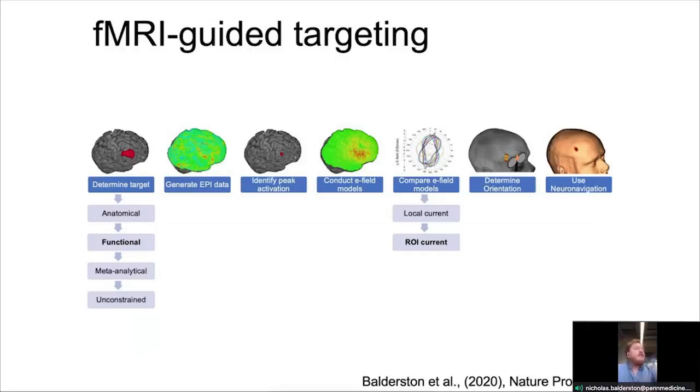The idea is that you first determine a theoretical a priori target, and then you operationally define this in MNI space in some way. I'm interested in anxiety cognition interactions, so I used a working memory target of the DLPFC. I had the individual subjects do the working memory task in the scanner, and I extracted the peak of their working memory related BOLD activity.